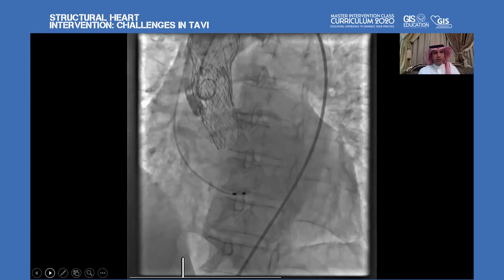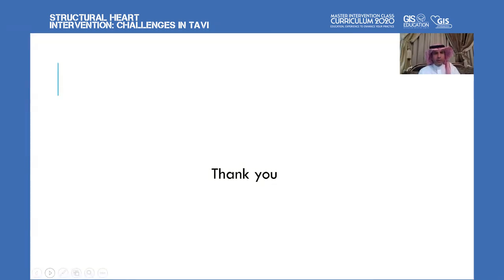I think Dr. Kraser joined us, so we'll go back to our panelists to comment on the final approach to Dr. Saleh and his case. So Dr. Lafont, what do you think? I think it's a case which has been well managed, and congratulations to the team. I just asked myself, because we didn't see this free cusp at the very beginning, to be sure that we were not a little tricked by the image. And for the position of the valve, it is absolutely critical to be sure that there is no parallax, as was said before.